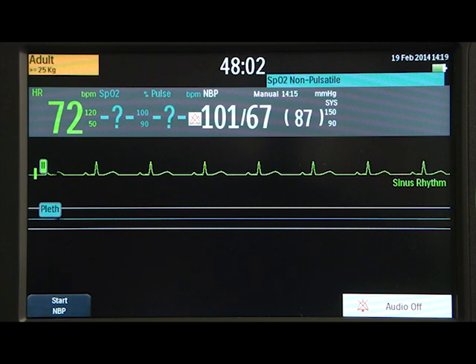this cyan background and sounds like this, or this.